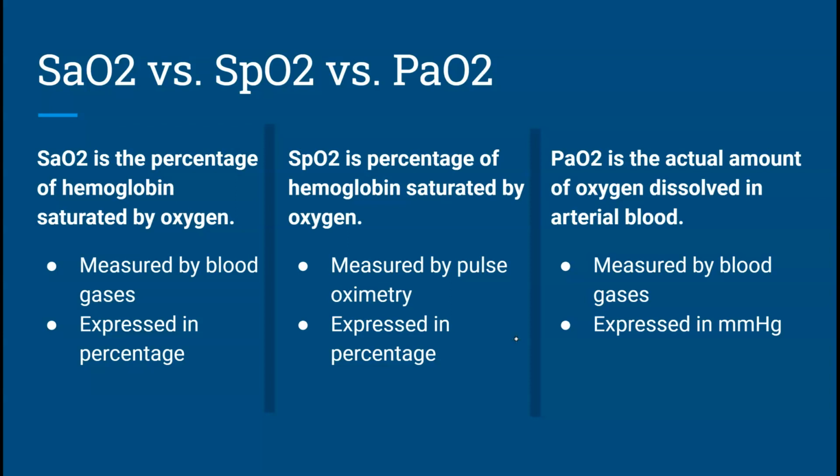Can the sticky ones work on the forehead too? Yeah. I've seen them just put the ones from the finger and stick it on the forehead. That's only the sticky ones, obviously. Not everybody has the sticky ones laying around. Those are usually liberated from a hospital somewhere. I've seen that done on infants.